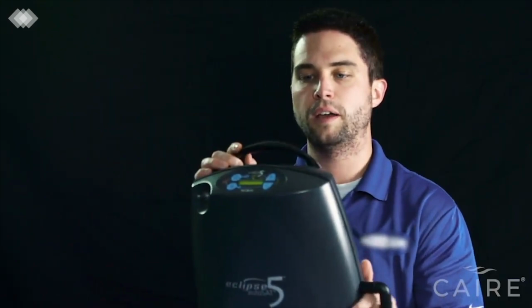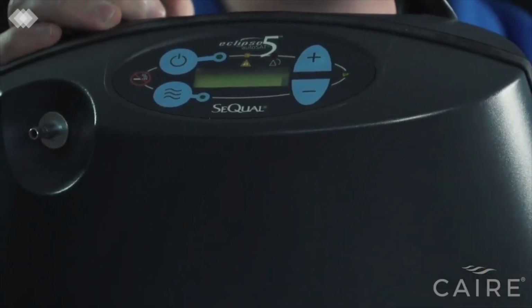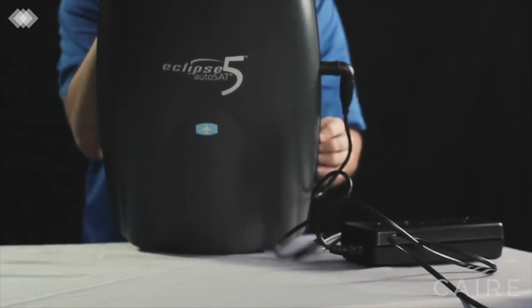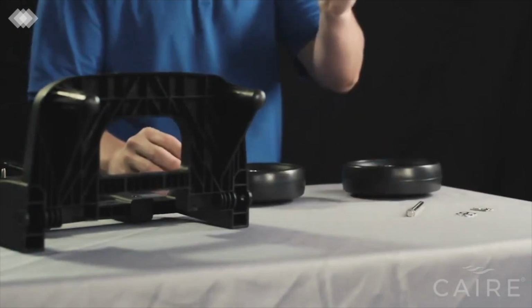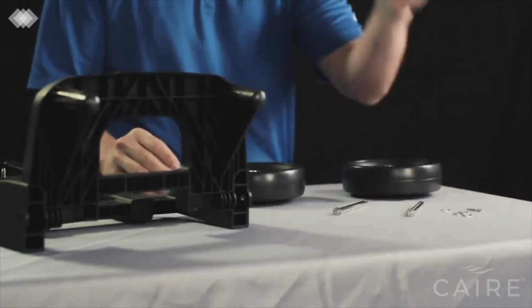The other thing that you'll want to look for, that you're connected to external power, is this light that's shaped like an electrical plug on the side of the control panel. If this light's on and the light on your brick is on, you're good to go and you're charging and running your machine. So the last thing you'll have to do is assemble your cart. This is pretty easy. You'll get the body of the cart in the machine along with 2 wheels, 2 axle rods, 4 washers, and 2 C-clips.